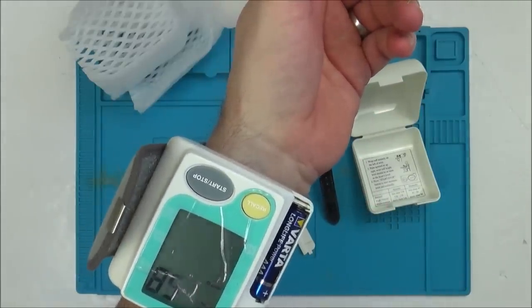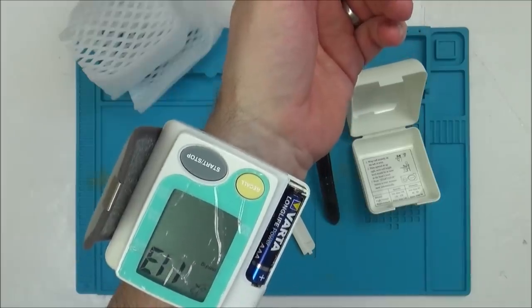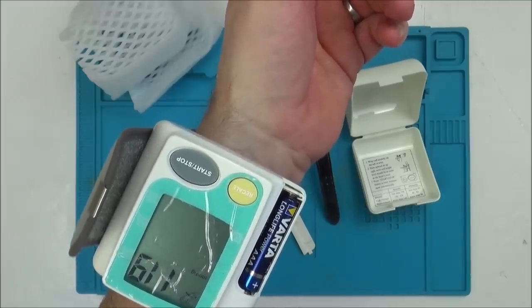I can feel it pumping up. Yeah, it's definitely getting tighter. Still getting tighter.